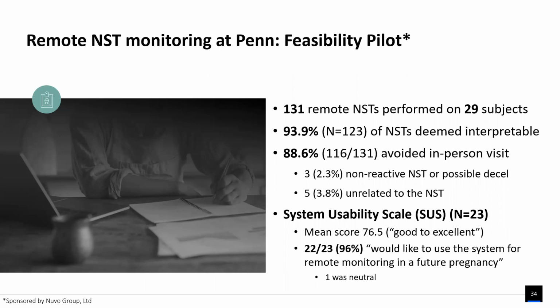And again, the idea here is not to specifically talk about their device versus any other devices that you might come across, but we just wanted to, for ourselves, understand what the experience would be like to actually send a patient home and have a non-stress test.